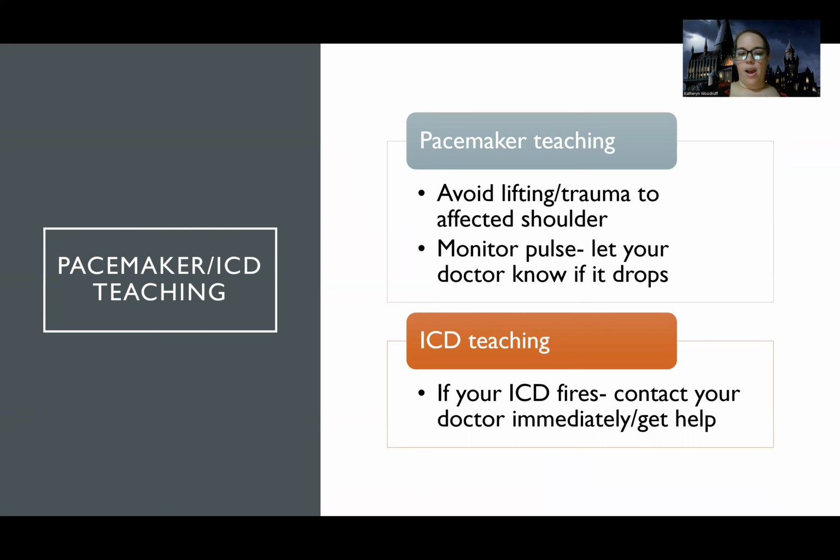ICD-wise, it's going to be a lot of the same teaching, but what's special for the ICD is that if it fires, we want to tell them to call their doctor immediately and get help. Think of it like this: let's say I was diabetic and my blood sugar dropped. I still need to report that to my doctor, because even if I treated it and I'm better now, we need to figure out what happened. Same with the ICD.